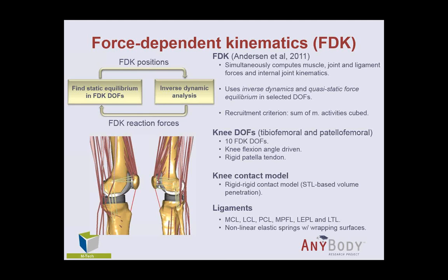All of those we search for static equilibrium between all the applied forces. So ligaments, contact, and so on. As contact model, we used a rigid contact model, which is based on the volume penetration of STL surfaces. So we have all the STL surfaces from the components, and then we compute an overlapping volume to generate the contact forces. And we included all the major ligaments around the knee, and all of them were modeled with standard nonlinear elastic springs with wrapping surfaces.